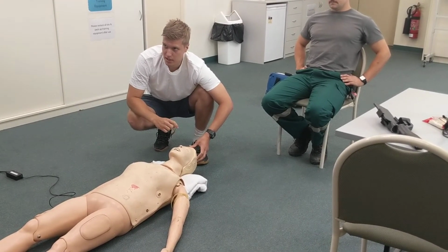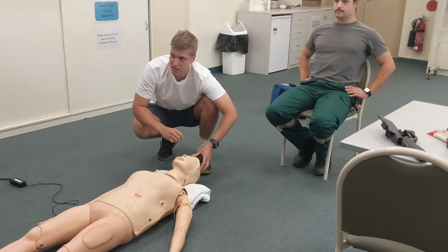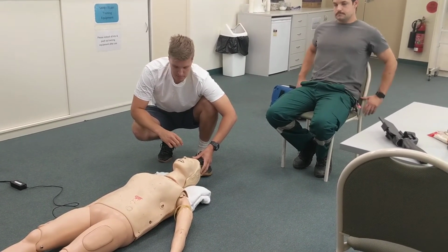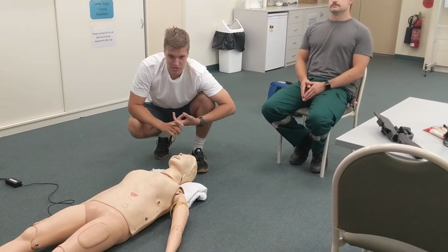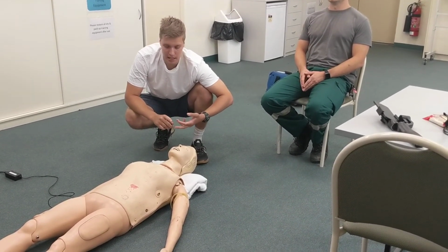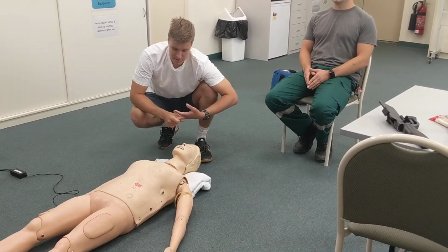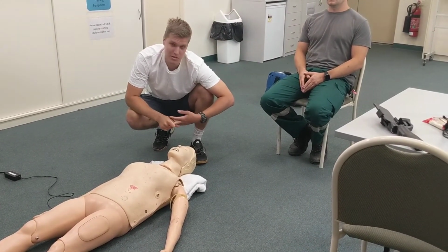If we go down a little bit further on our skill sheet there, we'll have a quick look through considerations again. Most of the time patients will see this in pre-RSI. Also, you're looking at unconscious patients in arrests, and I think that probably about covers it.